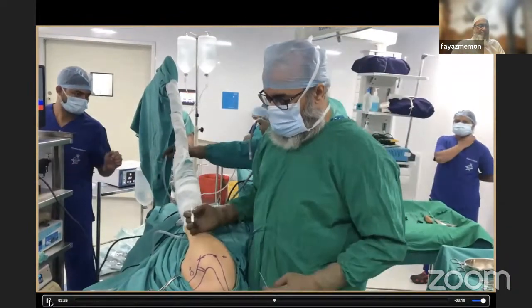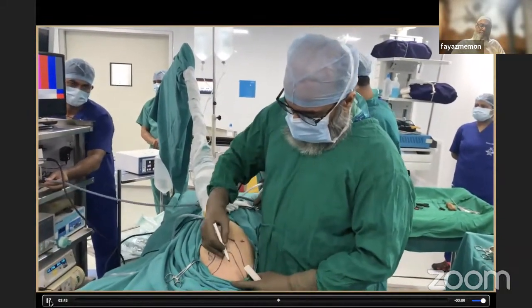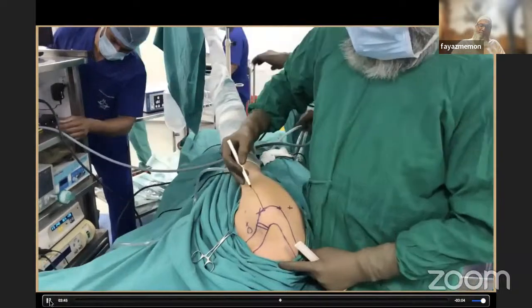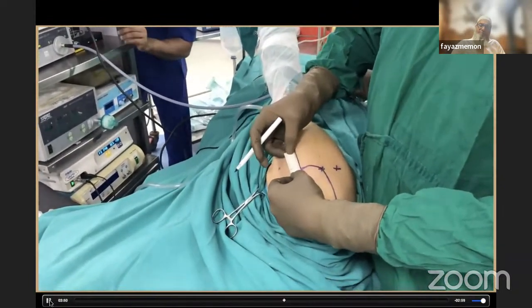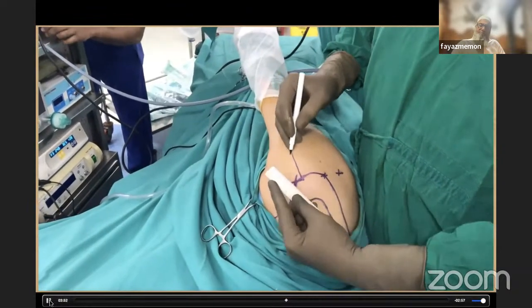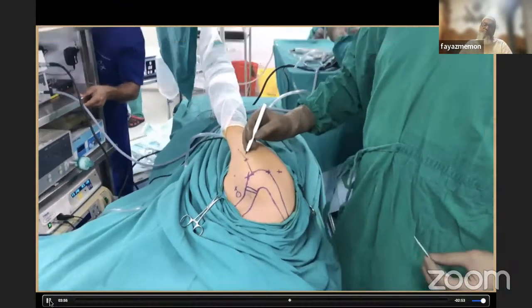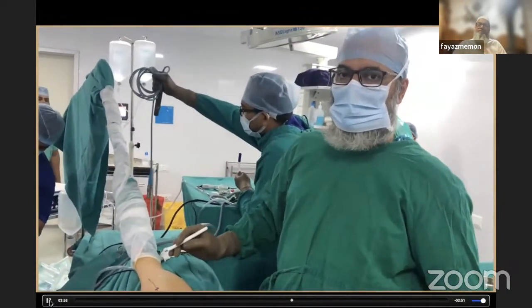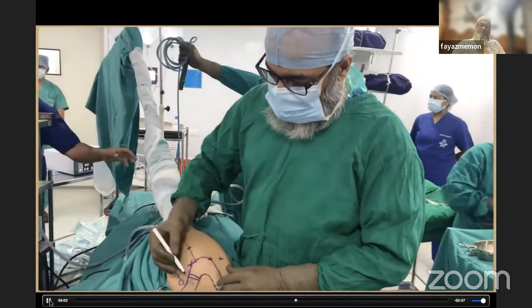Now, when you are doing a subacromial procedure, what you have to do is just draw this line, okay, and mark 4 centimeters from the lateral edge of the acromion, because below this you are going to encounter the axillary nerve. So you just do that, and then this is the safe area fairly.